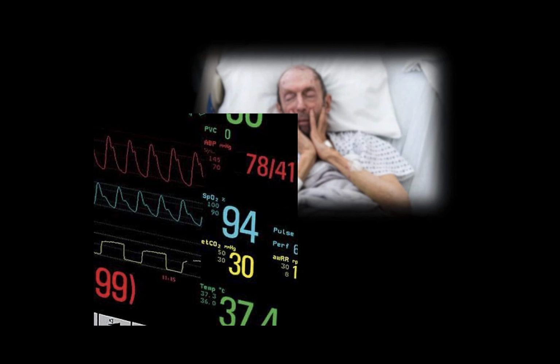That BP certainly is concerning. This patient is certainly in shock. But what kind of shock? The differential for this patient is not as narrow as the trauma patient, but is actually quite vast. Is this patient septic? Does he have a PE? Does he have an acute myocardial infarction, or is he just dry? Would you use an ultrasound in this scenario?